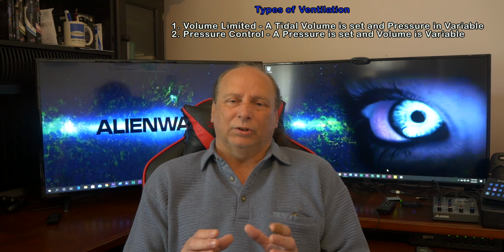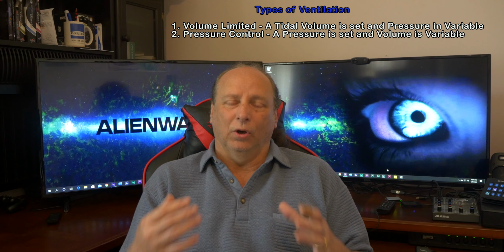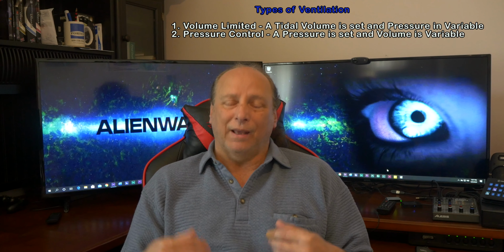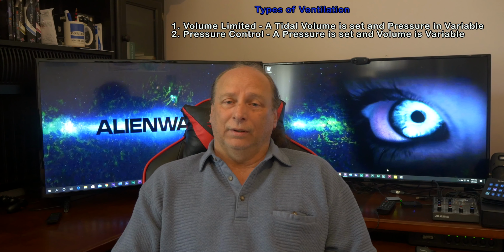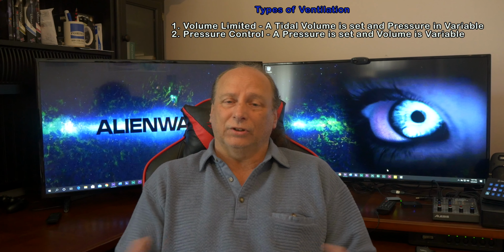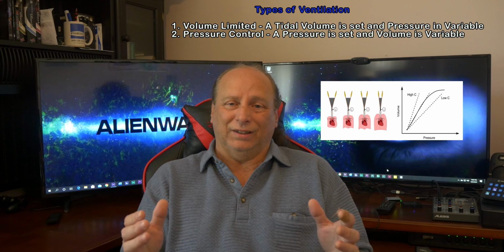Volume limited ventilation is where you set a tidal volume on the ventilator, and that tidal volume is going to be delivered no matter what to that patient. If you set 350 milliliters tidal volume, that patient's going to get 350 milliliters. But the pressure it would take to get that volume is variable based on the compliance or stiffness of a person's lungs. So if a person has a very stiff lung and we set up a tidal volume of 350, they're going to get 350. But that pressure, because they're stiff, may be way up there, like 50, 60 centimeters of water pressure to deliver, to be able to get that.